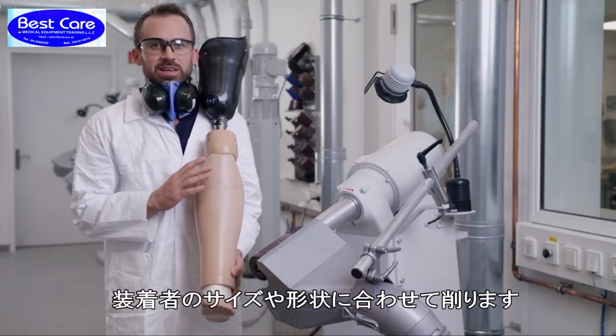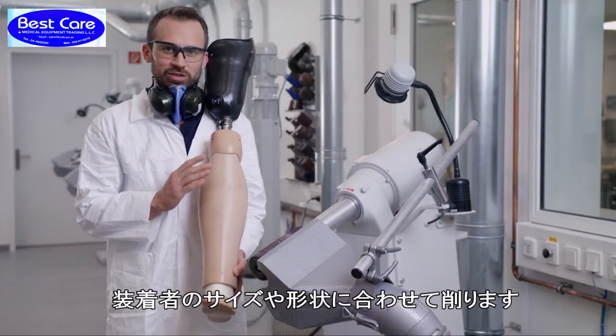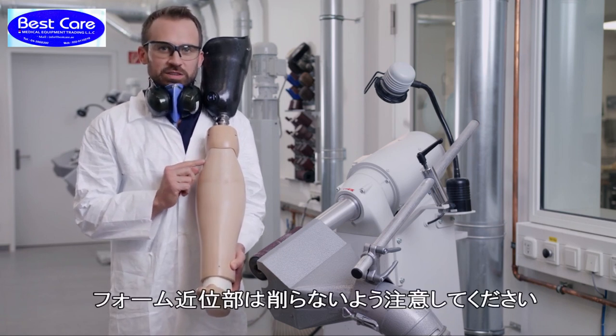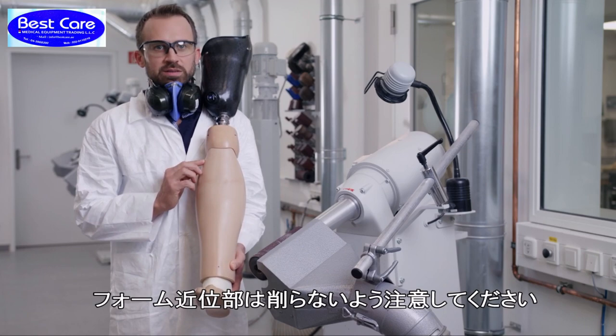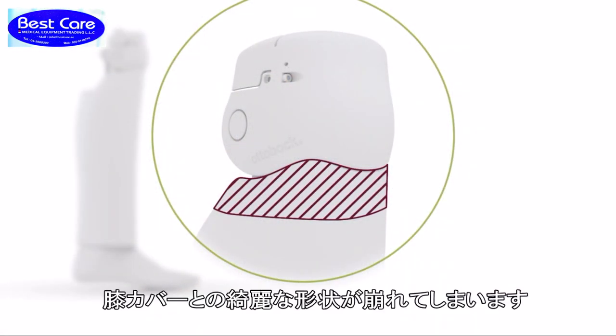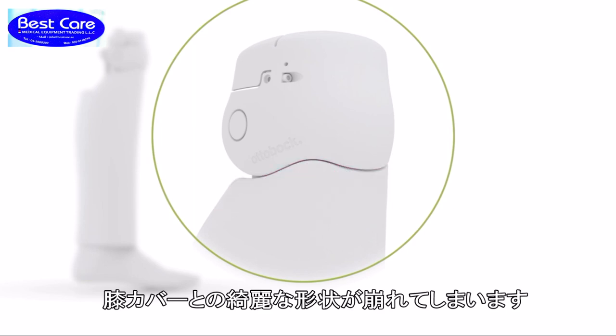The shape of the shank can now be sanded according to your customer's individual measurements. Please note that the upper section of the shank may not be sanded. If it is sanded, the transition between the knee and shank contour will not retain its attractive shape anymore.